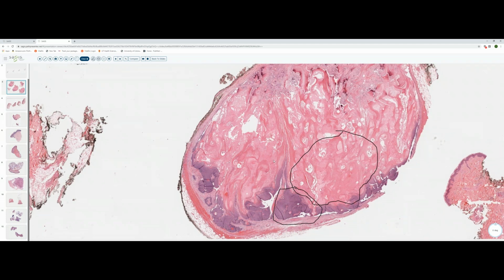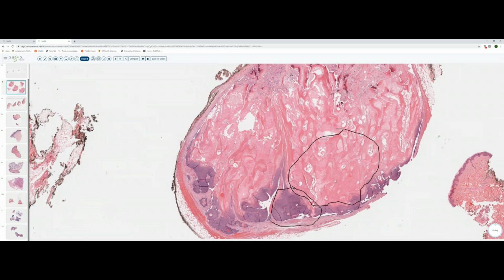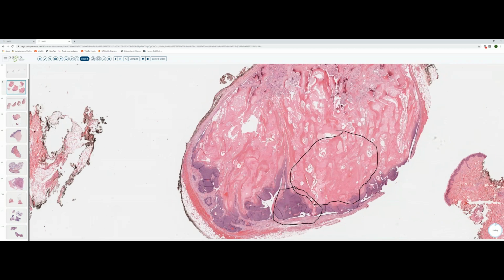Of course, we see that most commonly in pilomatricomas, but occasionally you can see matrical differentiation even within mixed tumors, which tend to be folliculo-apocrine or largely apocrine tumors. So salmon color, think shadow cells, think follicular differentiation. And this, of course, is an example of a pilomatricoma.